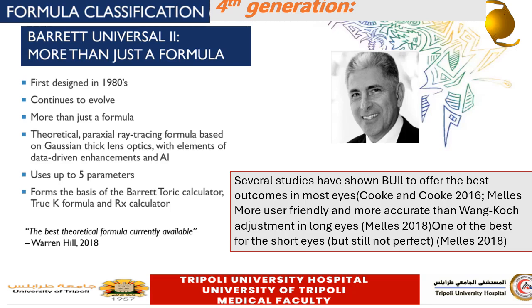That's for when you have a wrong calculation of the IOL, and you must decide whether to explant the lens or do a piggyback lens. So he has a special formula for the calculation for that error. We will speak in detail about the principle of this formula, as it is one of the famous and most popular formulas used now, known as the Barrett Universal formula.